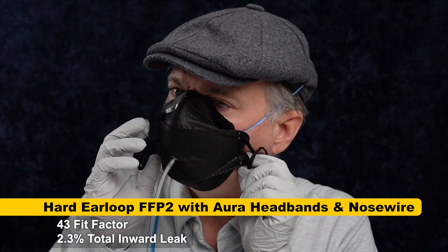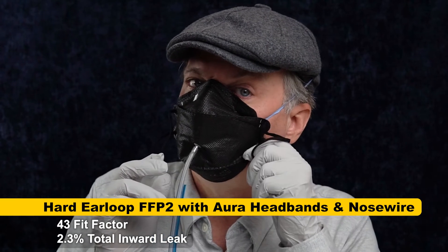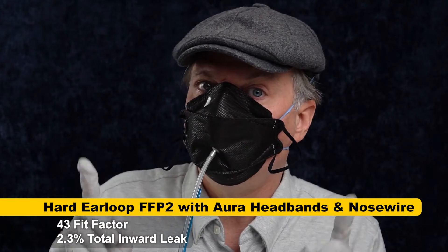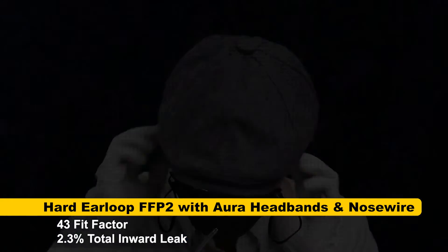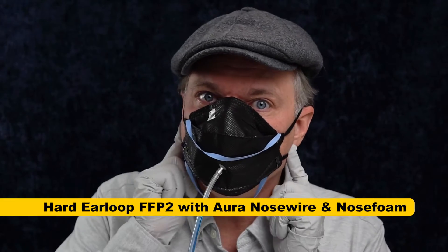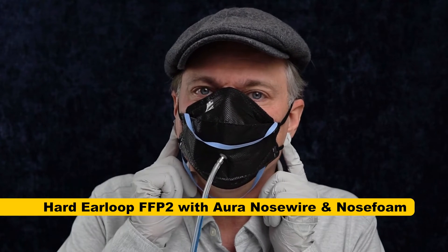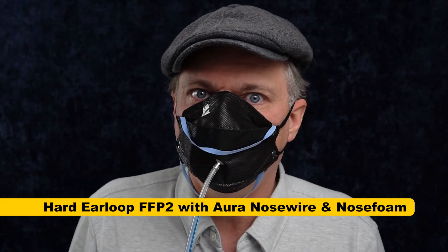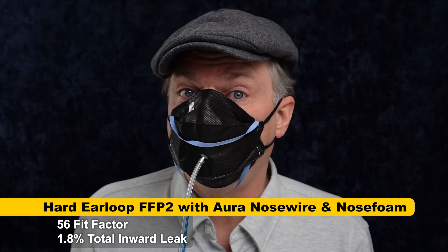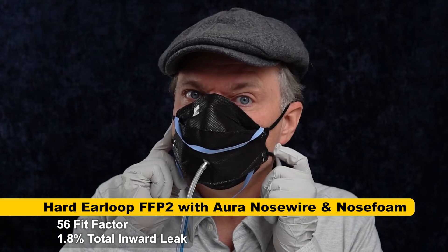The way I've attached the Aura straps, the doubling up may be providing extra space and it's not fitting as tightly, so I'm still not quite getting Aura performance. But there's still one more measure to go — the nose foam. I've stuck it in with double-sticky mask tape. For this test we're doing ear loops plus 3M nose wire plus nose foam, and the result was 56. That seems enough of a difference to suggest the nose foam really does help as long as you've got the 3M nose wire, even with ear loops.